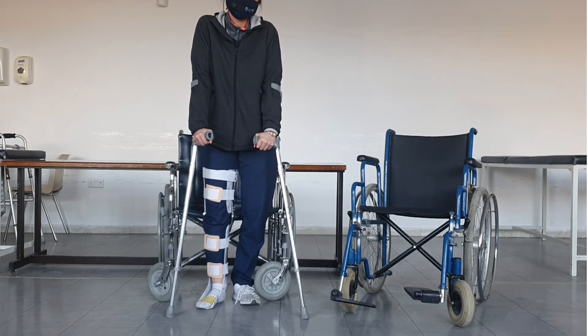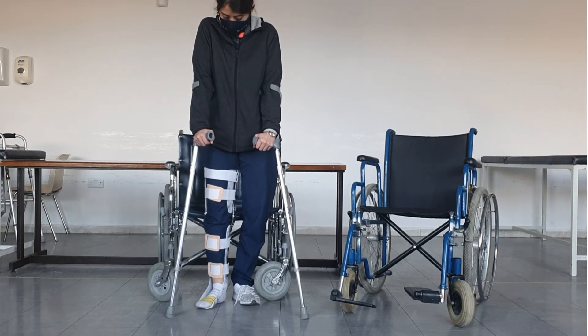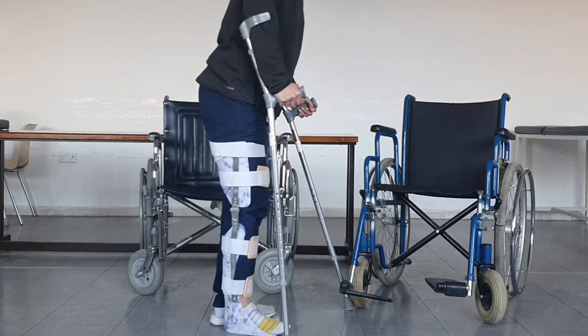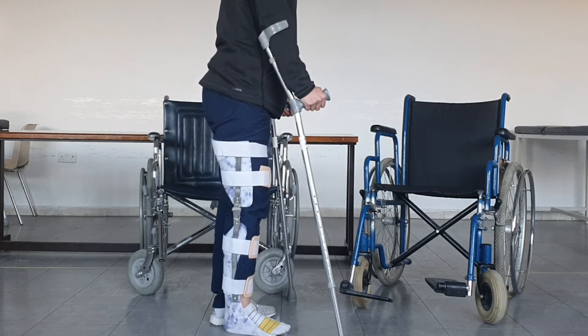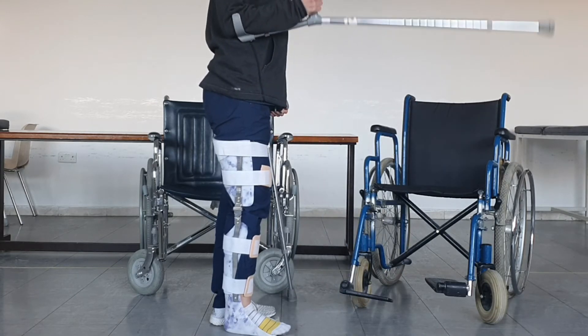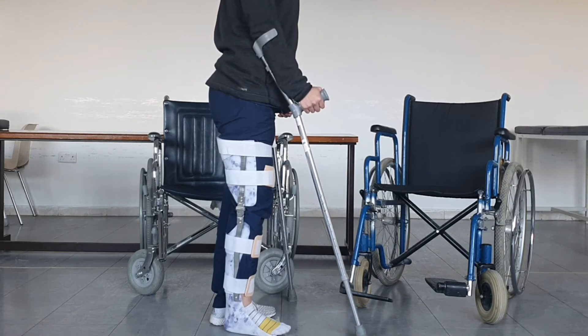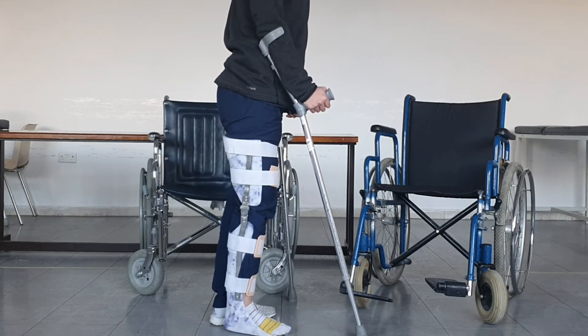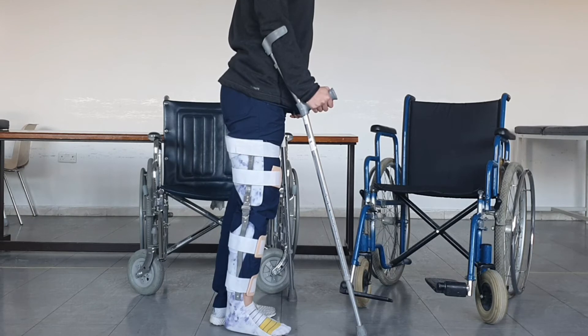For the KAFO — this is knee ankle foot orthosis — here we have two metal uprights to the side: one on the outer side and a similar one on the inner side. The metal upright connects two pieces: one is on the back of the thigh and the other is on the back of the calf muscles, and we have straps fixating it.